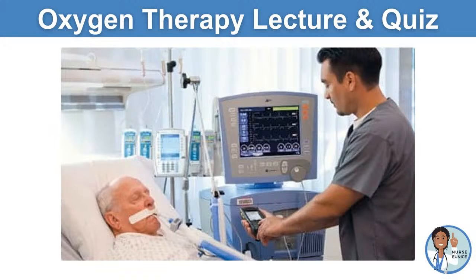It has settings, like the respiration rate. Maybe the doctor wants this person breathing 16 breaths per minute, and they want the FiO2 at 95%. The machine will take care of all of that.